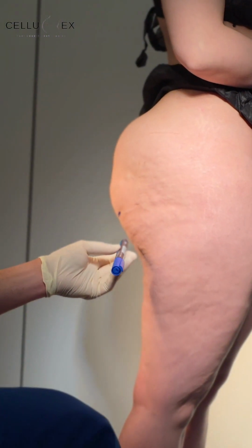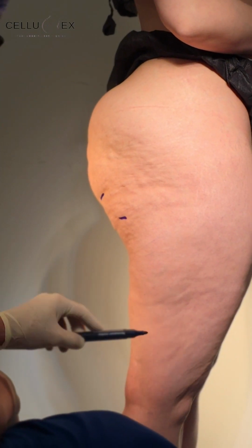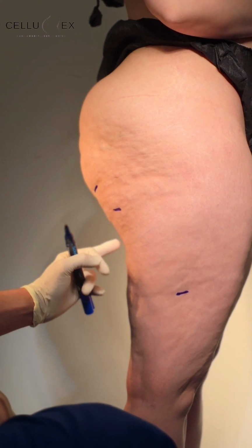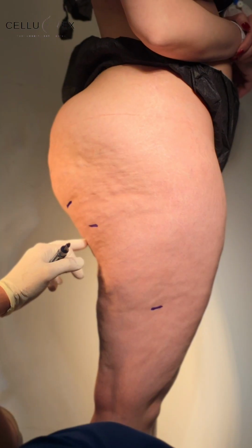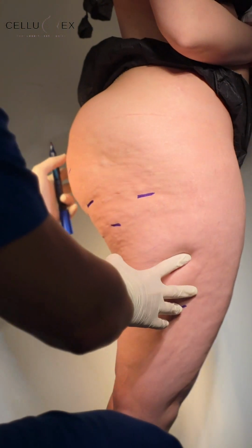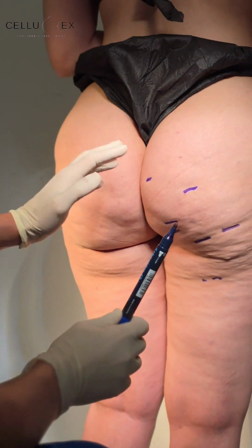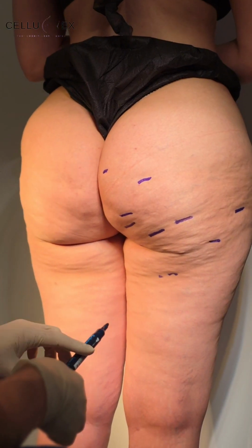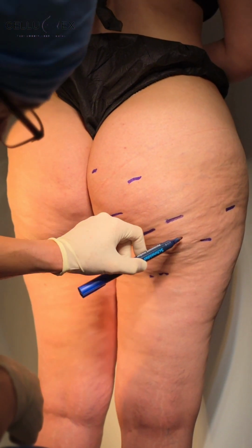There is another one here. You can find one about here also, which you can treat if you can reach. The incision is done exactly at the inferior gluteal fold crease. And it would show even better when you turn the patient around, you would see the cellulite under good lighting conditions.